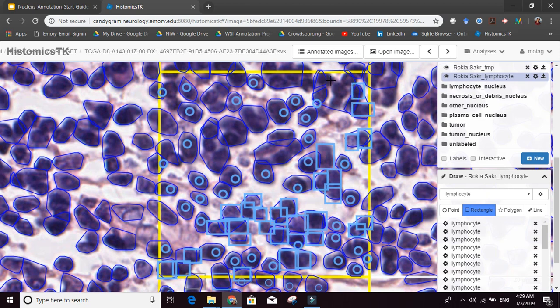This is a lymphocyte. This is a lymphocyte. This is a lymphocyte. This one, I think I already labeled it, but anyways, this one is a lymphocyte over here. This one is a lymphocyte over here. This is a lymphocyte over here.